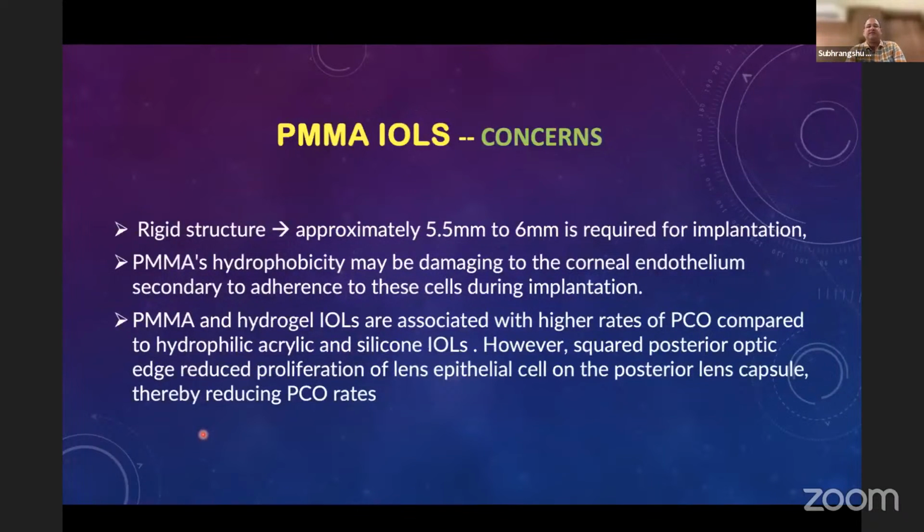Now, what are the concerns? A PMMA IOL being rigid will definitely require a larger incision for implantation. Its hydrophobicity may be damaging to corneal endothelium during implantation, secondary to adherence of these cells. And PMMA and hydrogel IOLs are associated with higher rates of PCO compared to hydrophilic acrylic and silicone IOLs. However, a squared posterior edge optic will definitely reduce this incidence.